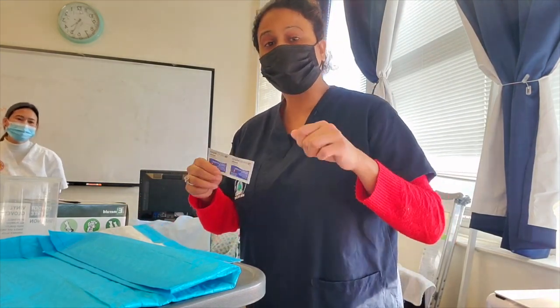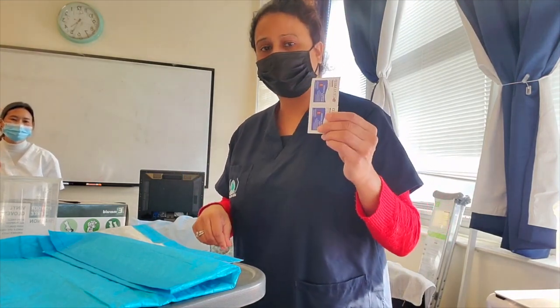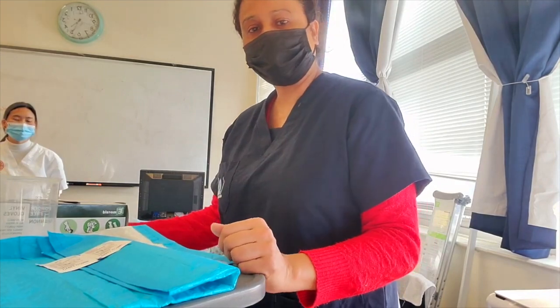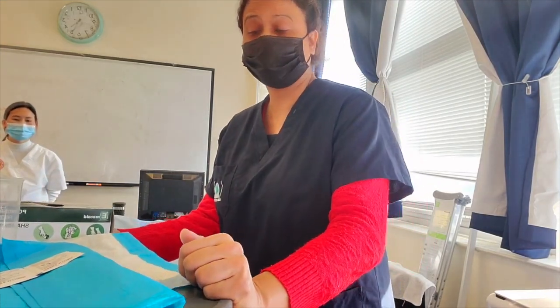I also have alcohol swabs to clean the port of the catheter, because that's an entry point for infection. When you open it to drain it, you have to clean the port. Now let's dive into the skill.